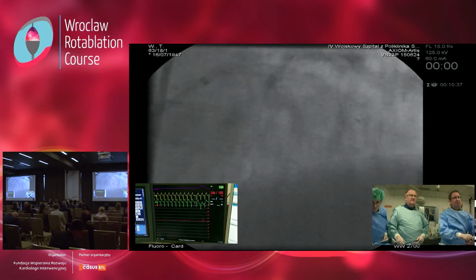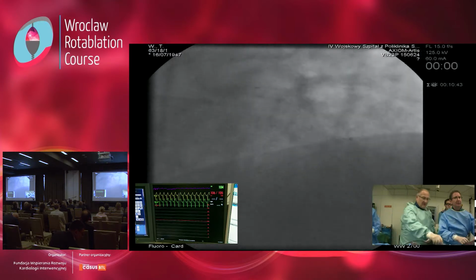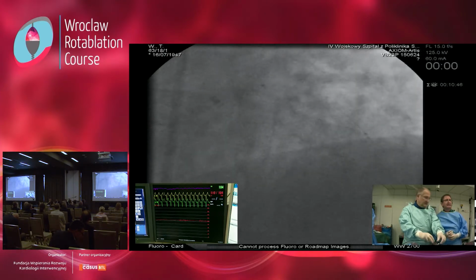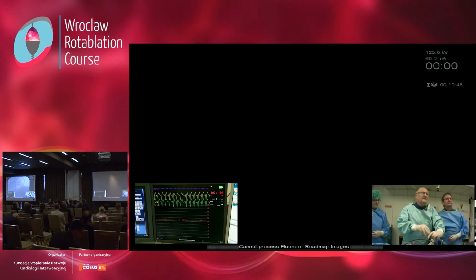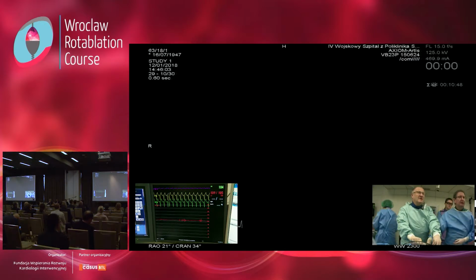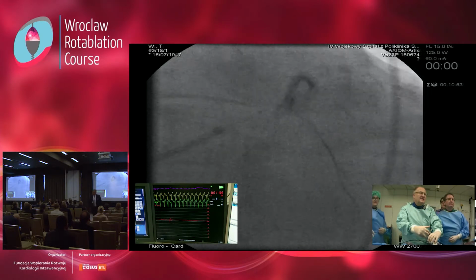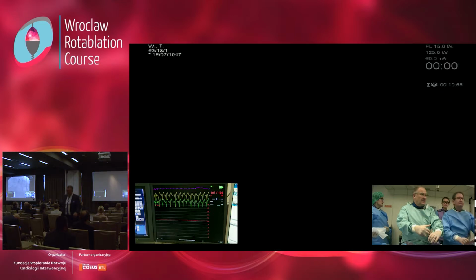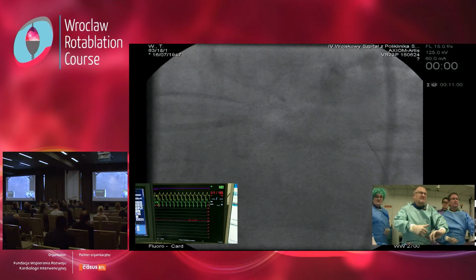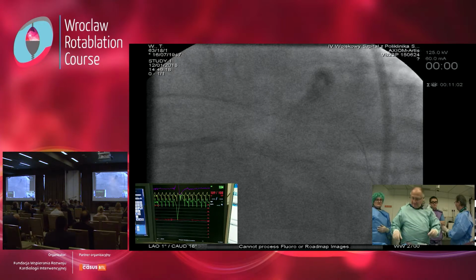So a very good option is just to go back with a balloon and test the length for the next stent. So we can use this. So we probably need 48, or we need one stent. Okay, check again. Check again. So definitely we would like to have now Synergy 3.5, 38, okay?